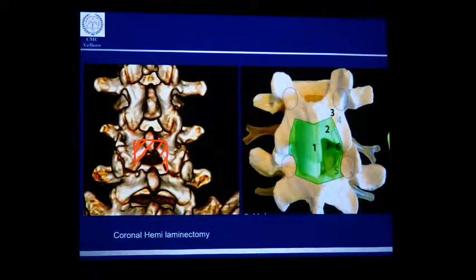So, if you want to remove the ligamentum flavum completely, you may have to remove some amount of the superior edge of the inferior lamina where it is getting attached, and go all the way superiorly until the ventral attachment of the ligamentum flavum to the superior lamina is removed. Once that is disconnected, the ligamentum flavum is free, and you can remove it after removing the attachment on the lateral side. For a patient with spinal canal stenosis, you will probably have to remove the ligamentum flavum almost reaching the pedicles laterally.